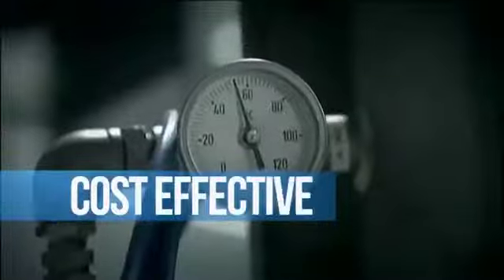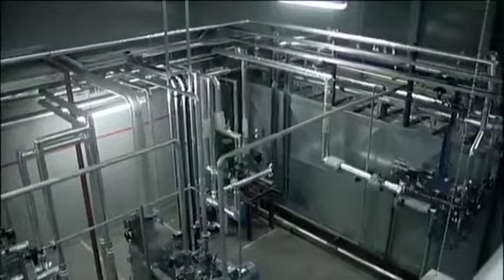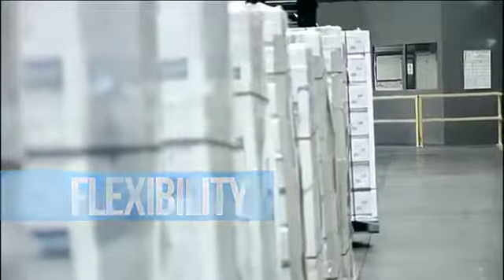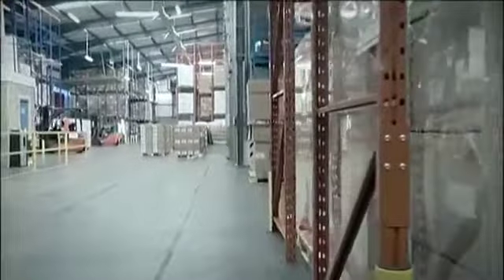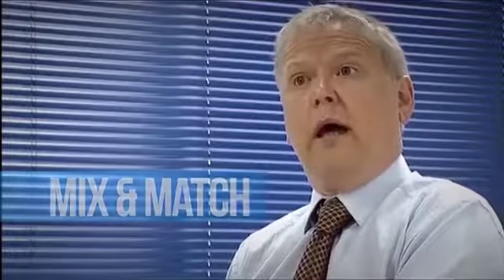There are a number of reasons why people would choose ethylene oxide. One reason would be cost. Ethylene oxide is a very cost-effective sterilisation method in that you're sterilising products in large volume. A second reason why people would choose it is for processing flexibility. A well-defined, well-validated process will allow a customer to sterilise a wide range of products in a single cycle. And that allows them a lot of flexibility to mix and match their product portfolio at short notice to meet customer requirements. A third reason is the impact on the product itself.